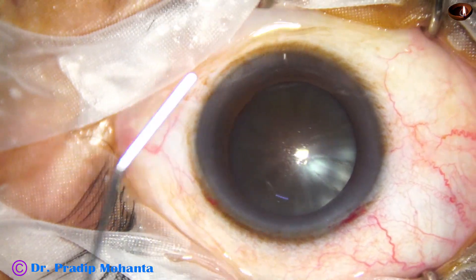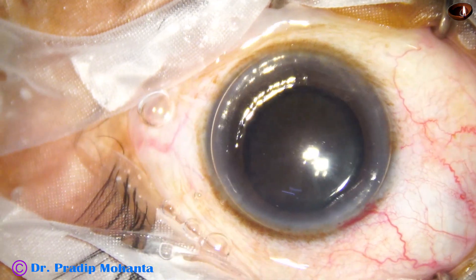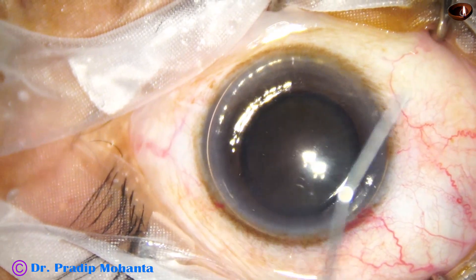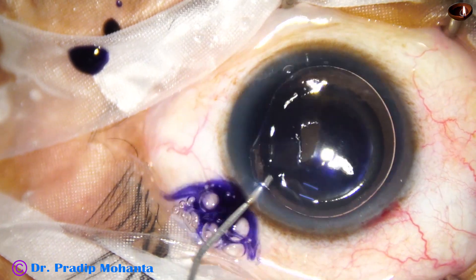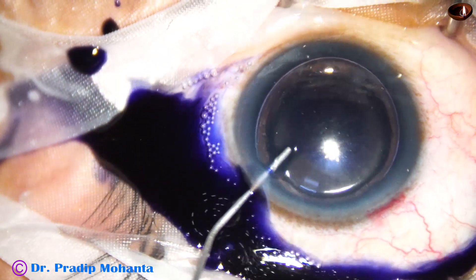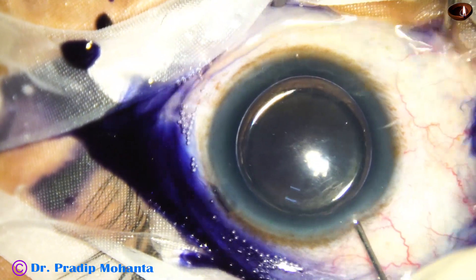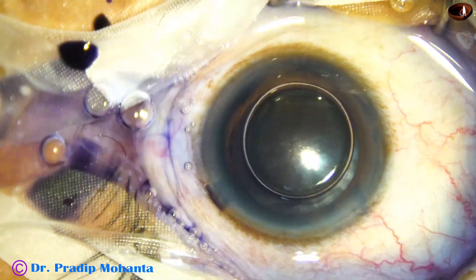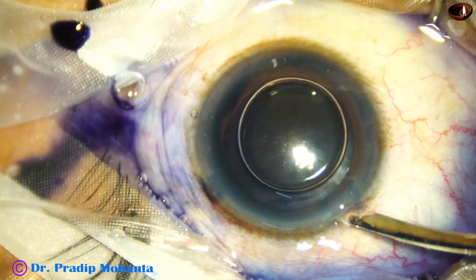Now I am going to stain the anterior capsule with trypan blue dye to get some contrast during capsulorrhexis. An air bubble has been injected, and beneath this air bubble, trypan blue dye is applied over the anterior capsule. A bit of adrenaline is used to maintain the dilation of the pupil, and now the dye is washed out.